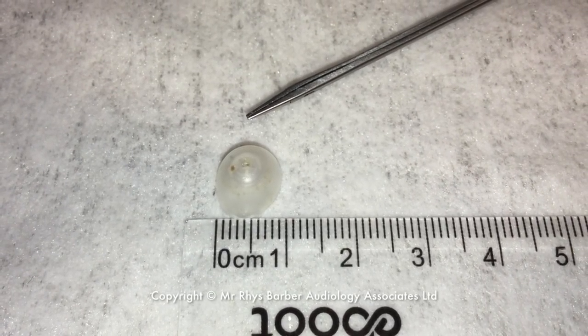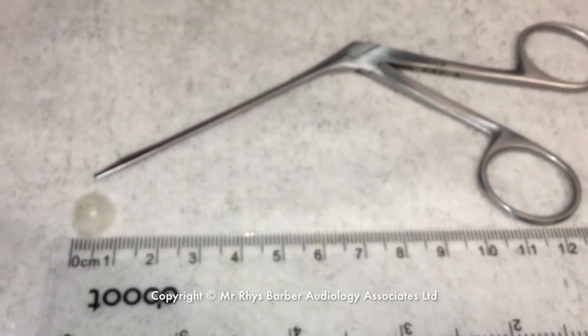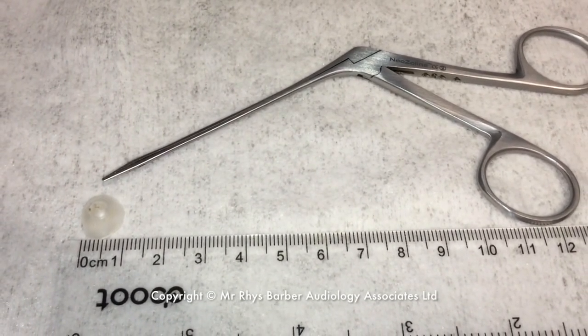So this is what we removed — this is the rubber dome that fits on the end, about a centimetre across. And that's the crocodile forceps we used to remove it. There we are.